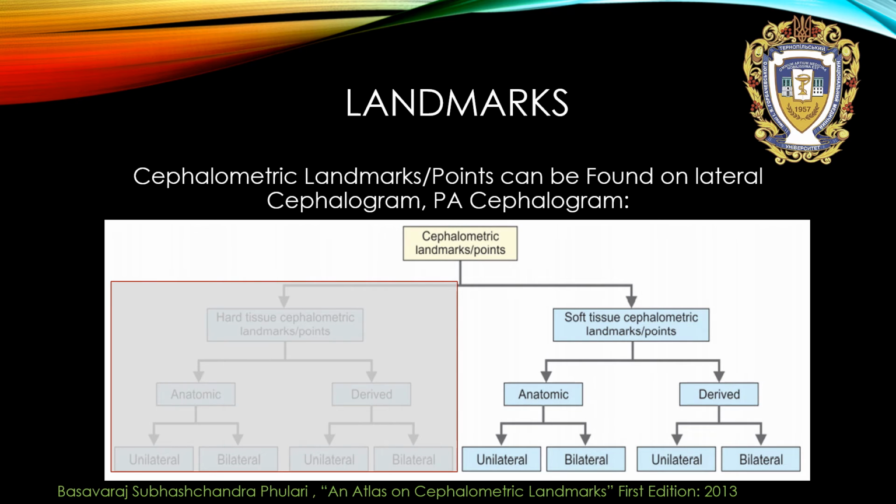And now let's talk about soft tissue cephalometric landmarks. They can be anatomic or derived, and everyone is divided into unilateral and bilateral.